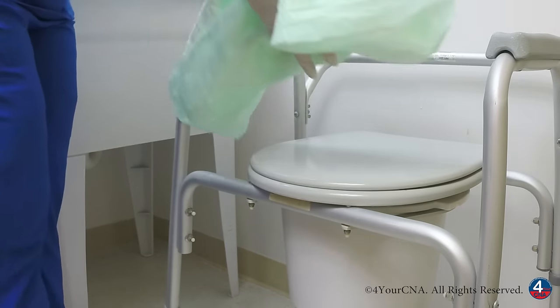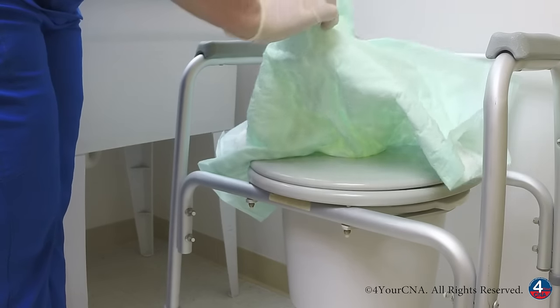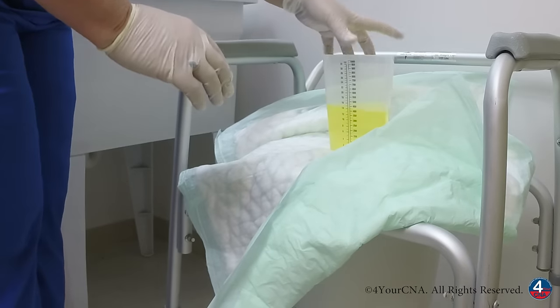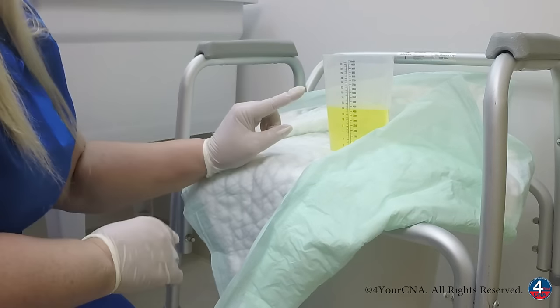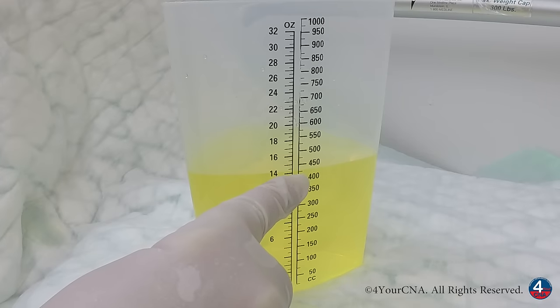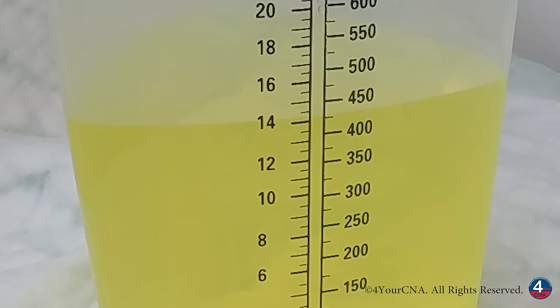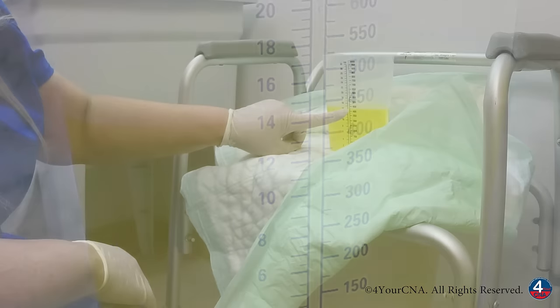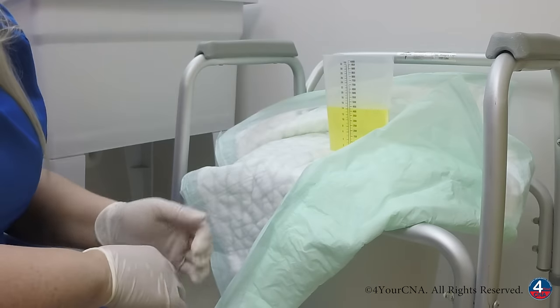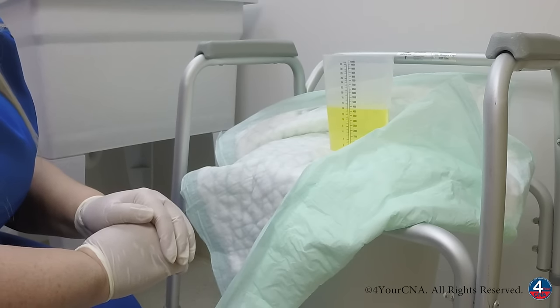Once we're at the patient's bathroom, we're going to set the graduate container down on a barrier on a flat surface and position it so that we can read it. We need to be at eye level and we're going to round to the nearest line, either up or down. You can see that the urine in this container is nearest to the mark of 425, so the amount that we will document is 425 milliliters, or cc's.